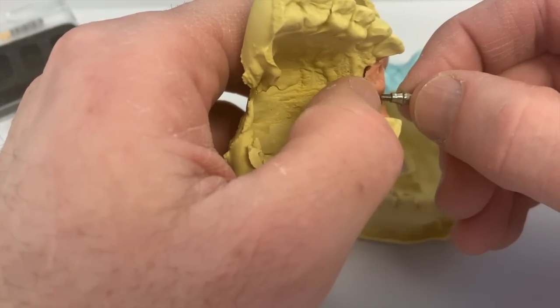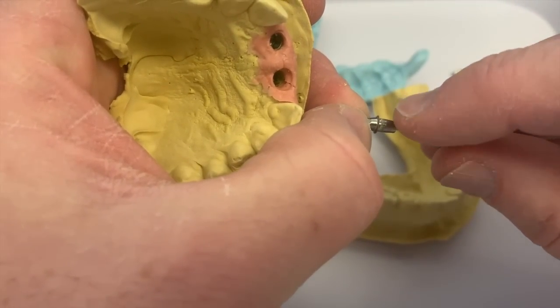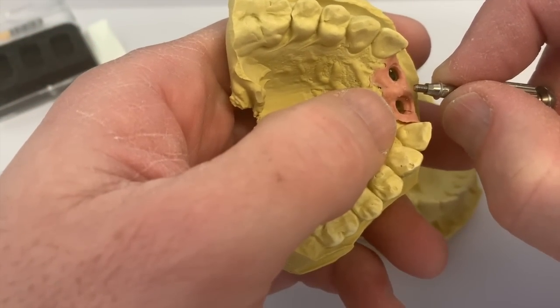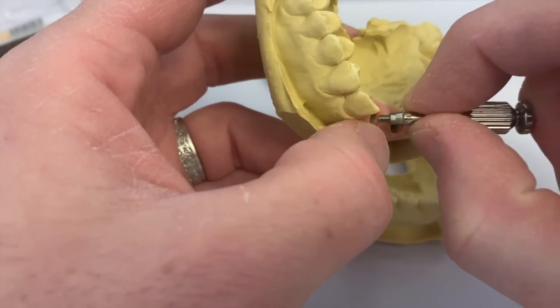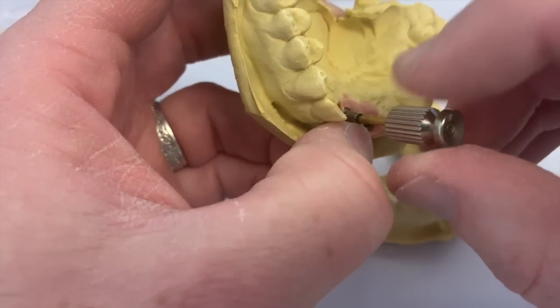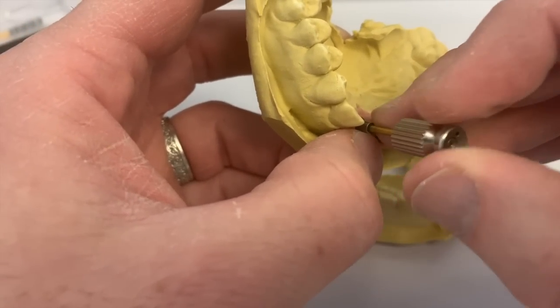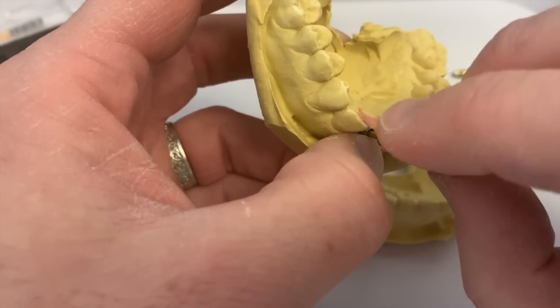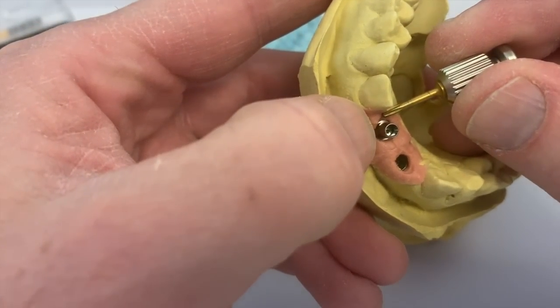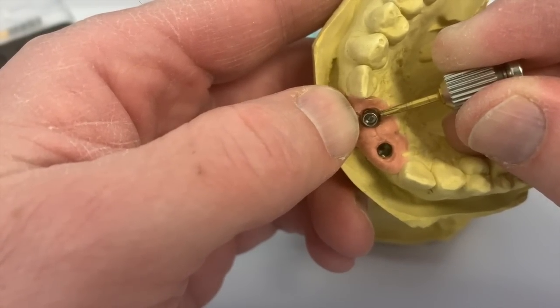I want to be careful about where I place the notch. You can see the notch right there on the top of the tibase. Because the sprue generally is rotated 90 degrees from the notch, I'm going to intentionally orient this one so that the notch is going to the distal, which will place the sprue, let me get that to engage, there we go, on the lingual. So you can see if I pull this out of the way, there's the notch on the distal, which means that sprue, when it's milled, will be coming out this direction.